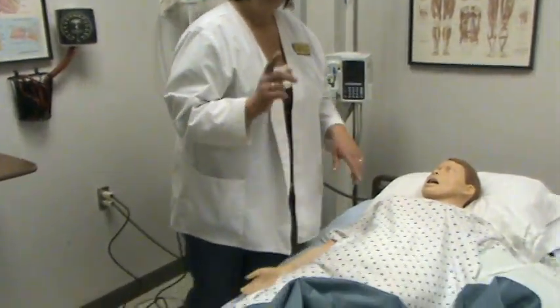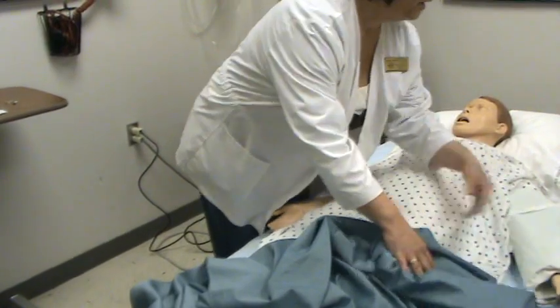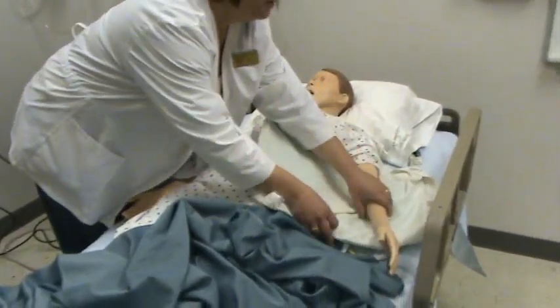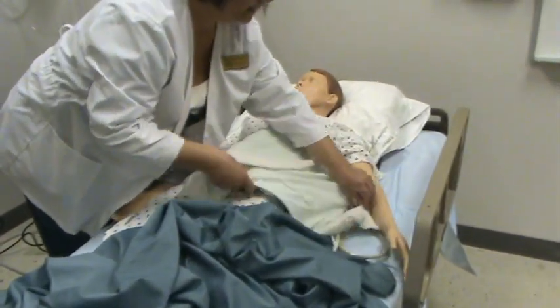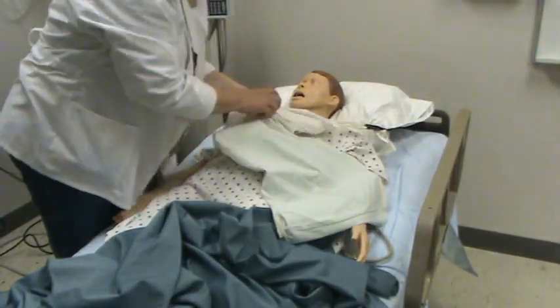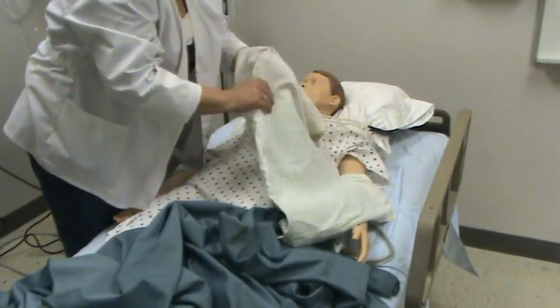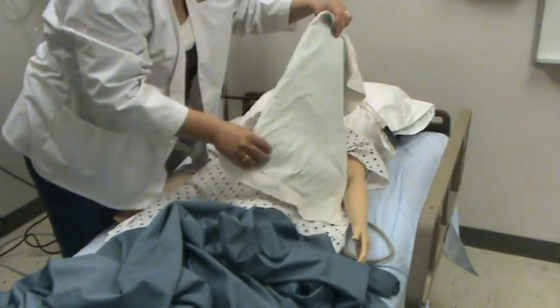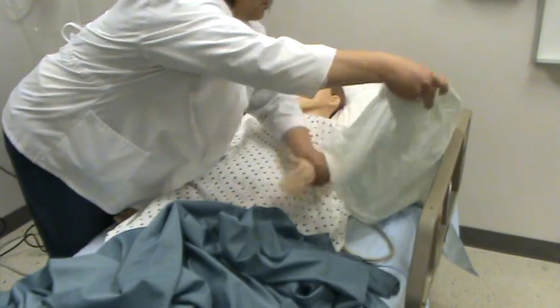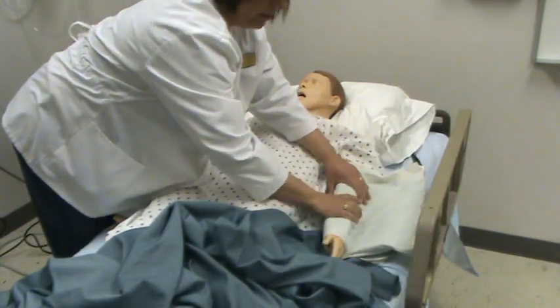For hot therapy, we use an Aqua K pad. An Aqua K pad is just a plastic pad with heat going through it, and I've got it covered in a pillowcase. You don't want that directly on the skin, so I've got a pillowcase over it and have it placed on the affected area.